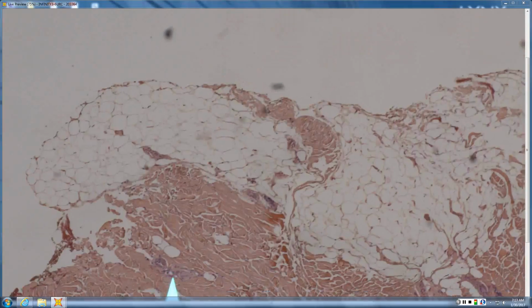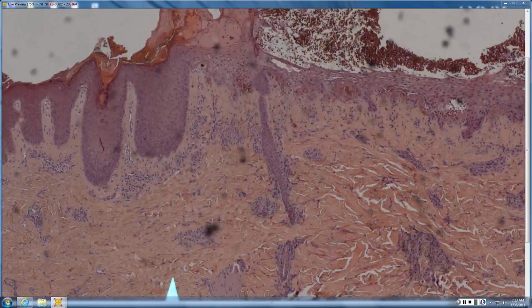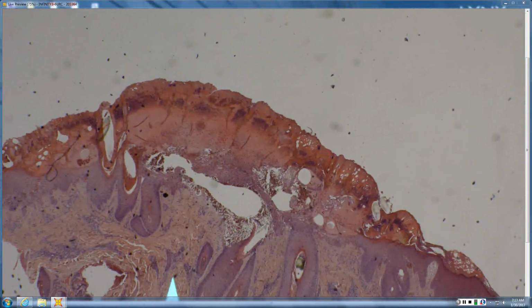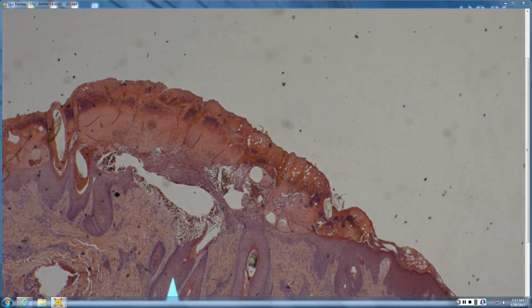Okay, so this one is just supposed to be impetigo, and the trouble with impetigo is, what you're seeing, the organisms, is that the primary process? Is that what the clinician wants you to find or needs help diagnosing, or is it just secondary impetiginization of whatever else is going on? So in this case, it's read as impetigo in like a scale crust. And obviously, you can see all this. This is the scale crust that the clinician is seeing, full of serum and some inflammatory cells.